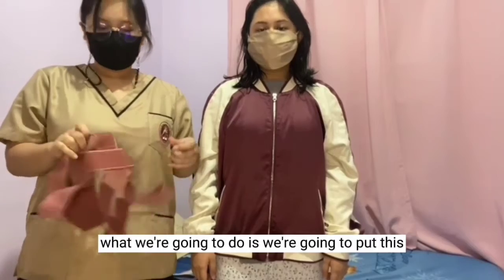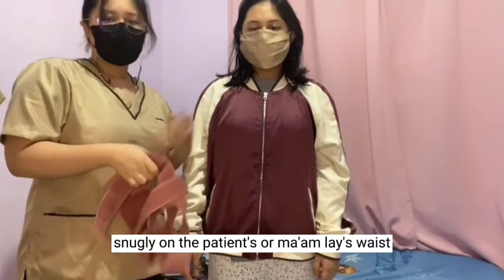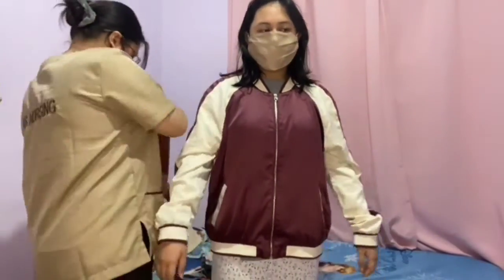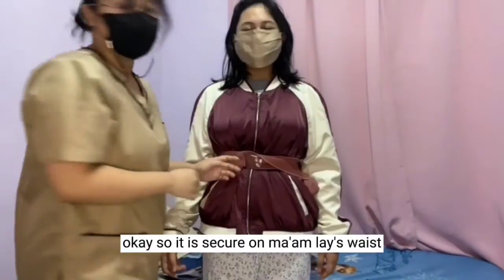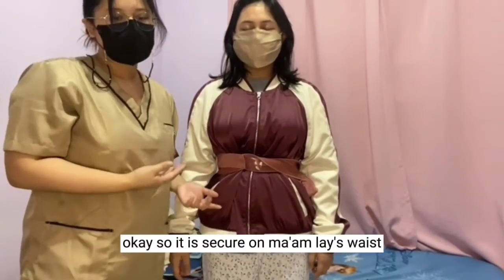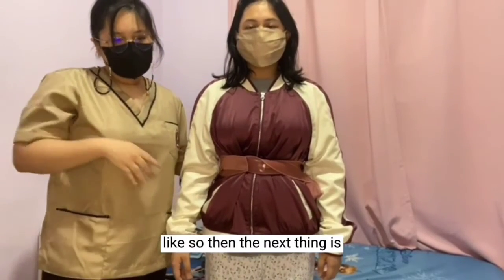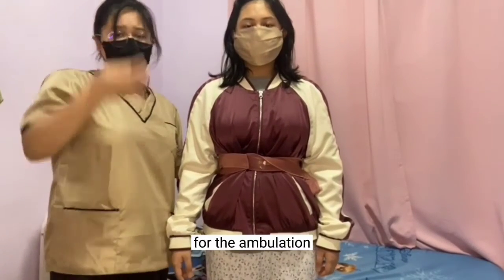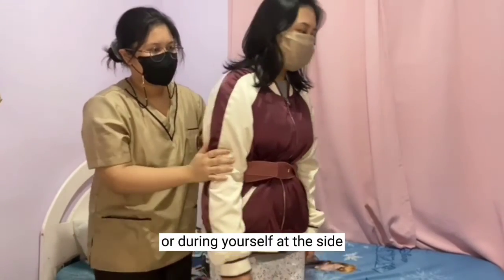What we're going to do is put this snugly on the patient's, or Ma'am Lay's, waist securely. Okay, so it is secure on Ma'am Lay's waist, and we have to fasten it securely like so. Then the next thing is we're going to prepare the client for the ambulation. So ma'am, can you please turn yourself to the side?